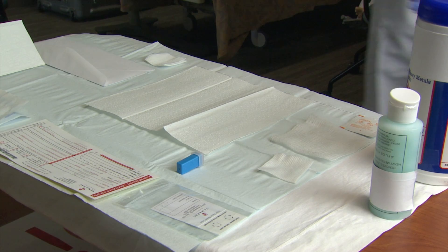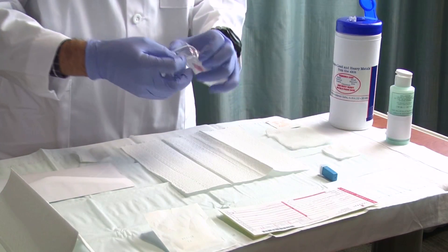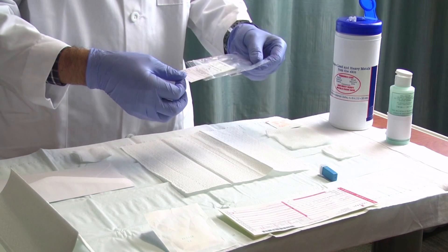Partially remove the filter paper from the plastic bag, just enough to write the required lab information. Do not remove the entire card from the plastic bag.